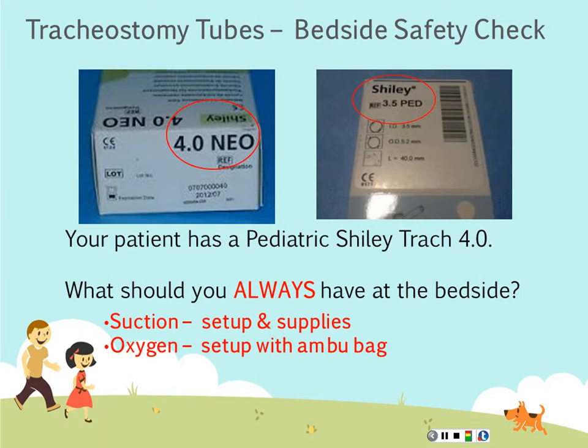The next thing you want to look at is, do you have oxygen and the setup with the Ambu bag? So do you have your oxygen tubing? Is it hooked up into the wall? Do you have an Ambu bag, and is it the appropriate size for your patient?